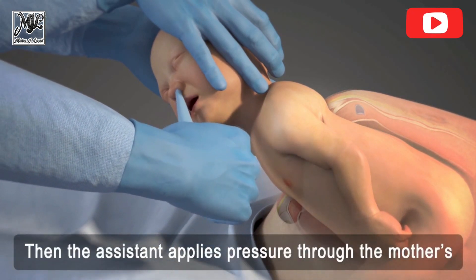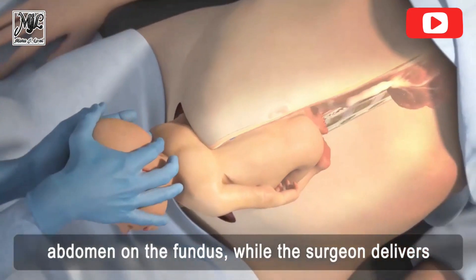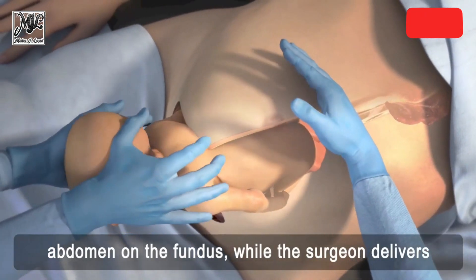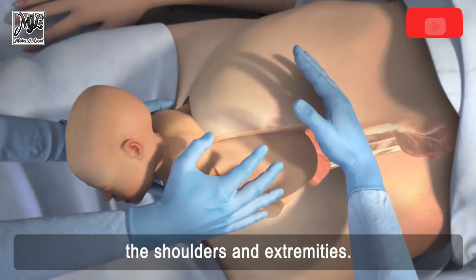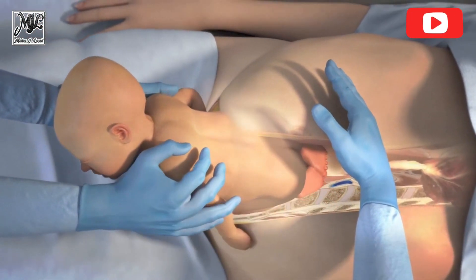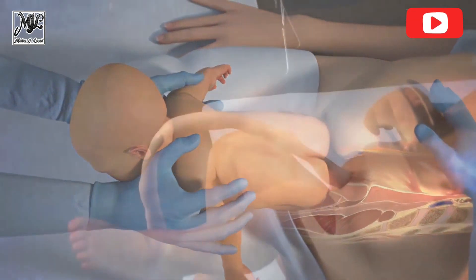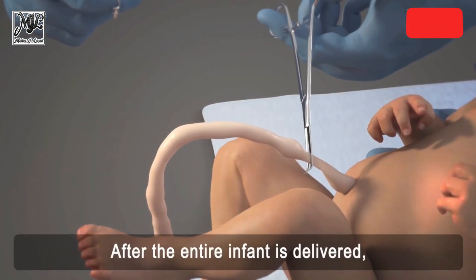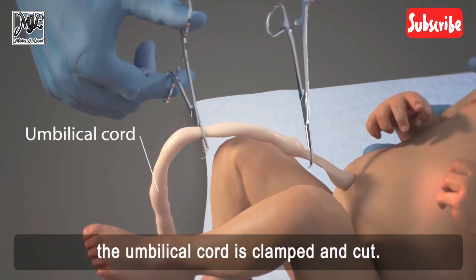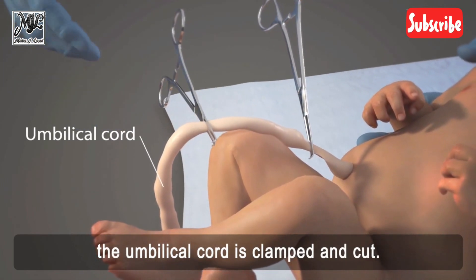Then the assistant applies pressure through the mother's abdomen on the fundus, while the surgeon delivers the shoulders and extremities. After the entire infant is delivered, the umbilical cord is clamped and cut.